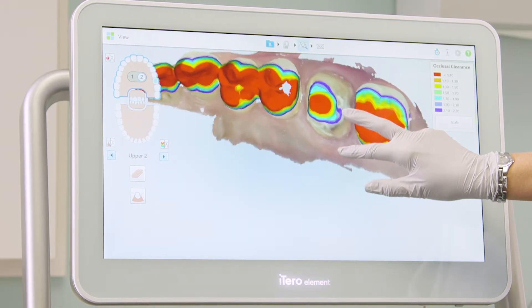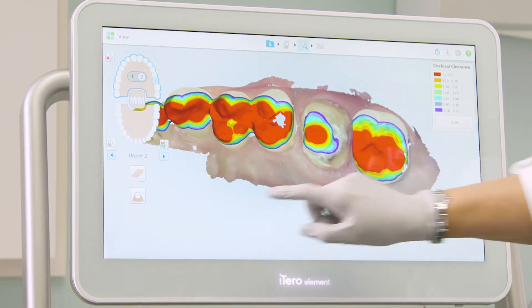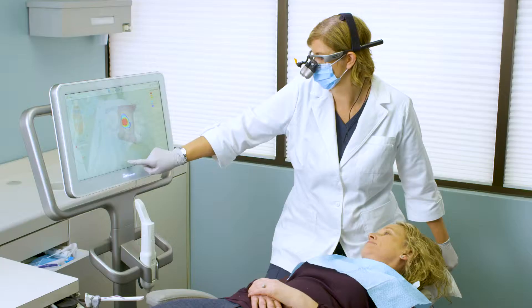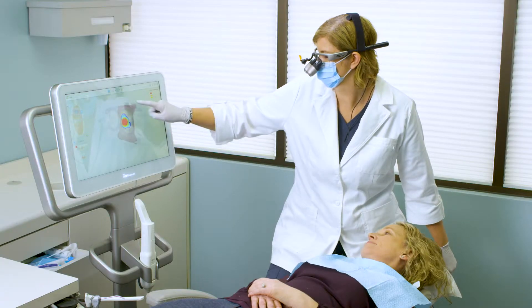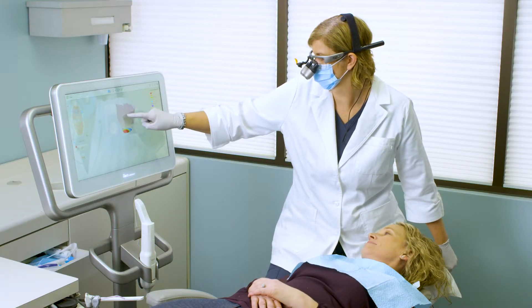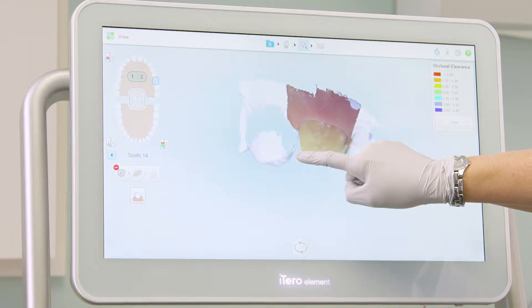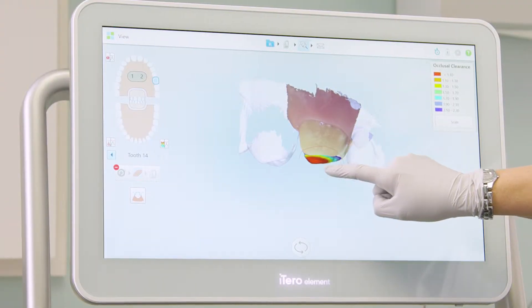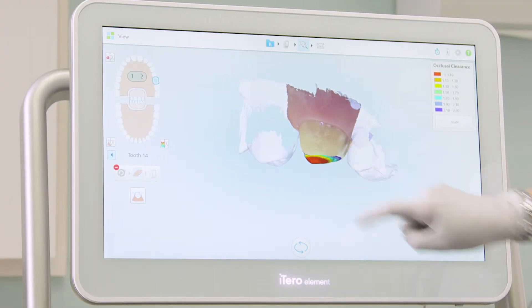First, I will tap on the eraser icon. Rotate the model to the buccal view. Use my finger to circle the area that I reduced.